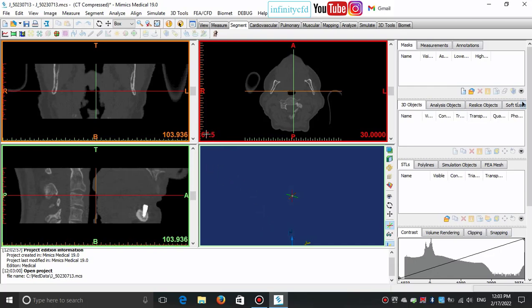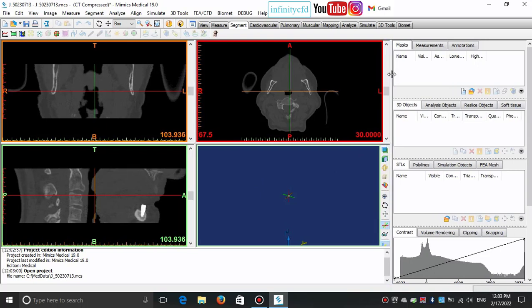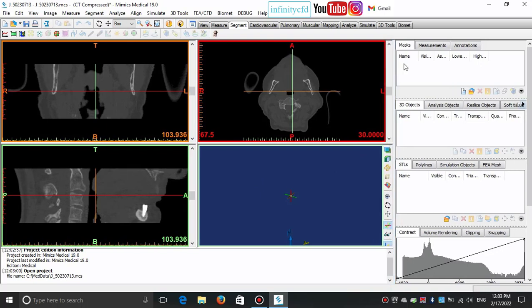Hello everyone and be well everywhere you are. In the previous video, we imported the CT scan images into Mimics and got familiar with views orientation. As I said in that video, the first step after importing the images is mask creation.